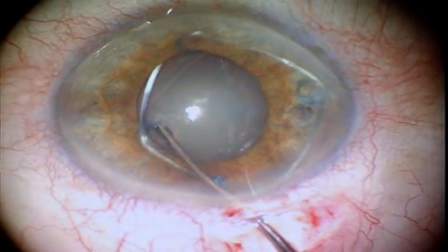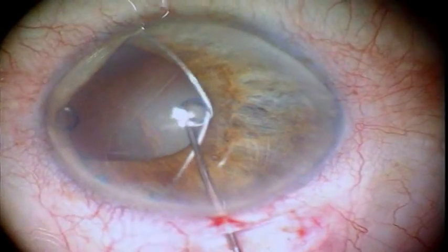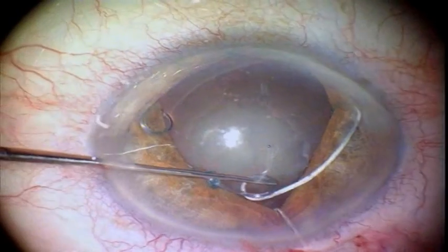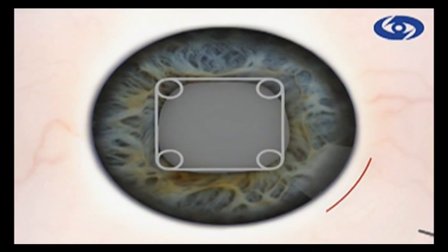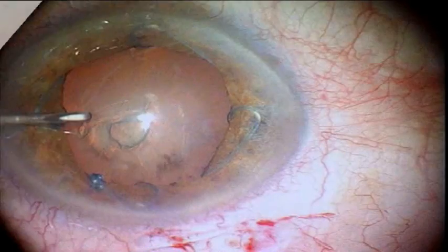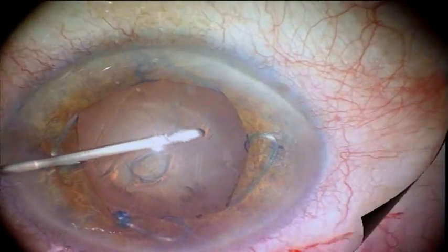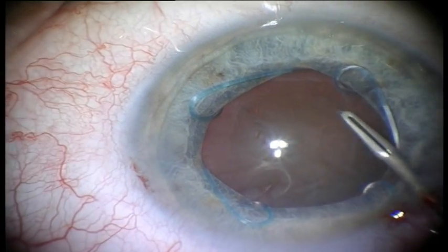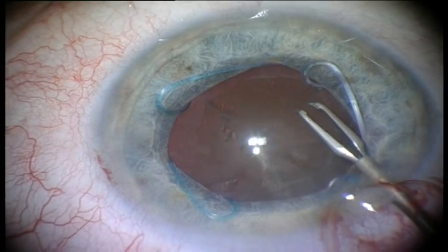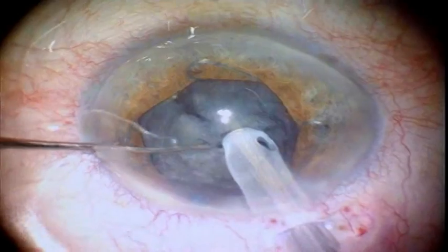Even in patients with extremely atrophic iris tissue, the implantation and positioning of the ring is not difficult. In these cases, a bimanual technique of introducing the iris tissue into the circular loops is very useful. The ring does not complicate the usual steps of surgery. To open the capsule, one can use a bent needle or irrigating cystotome. During capsular access with forceps, the ring remains nicely stable and does not restrict the movements of the surgeon.